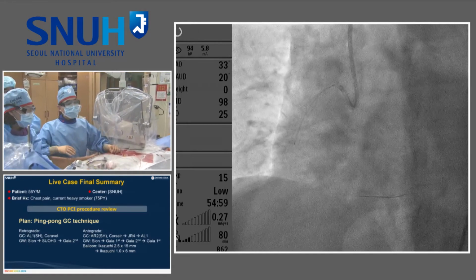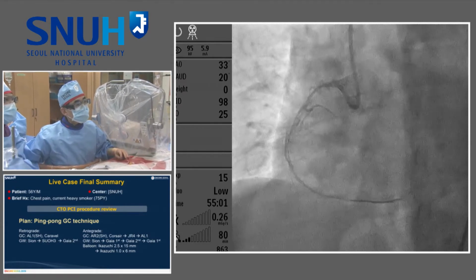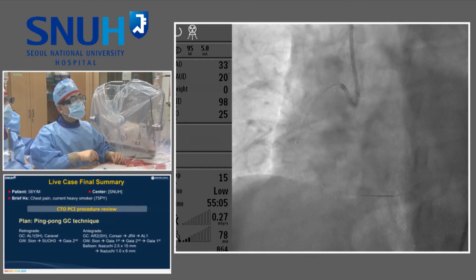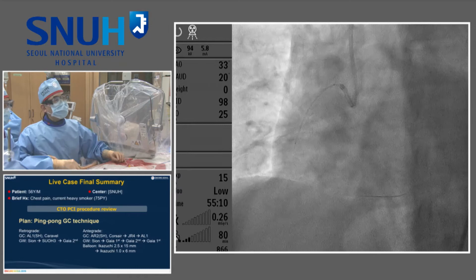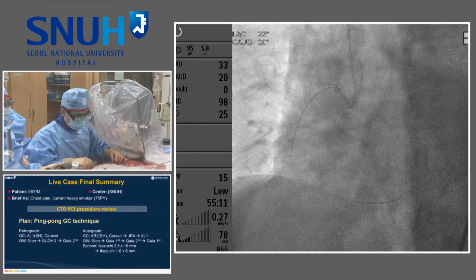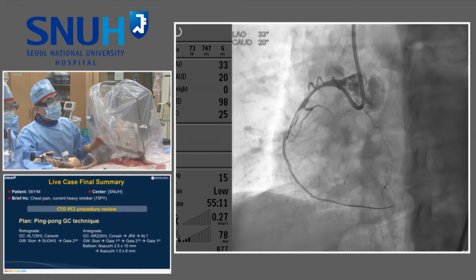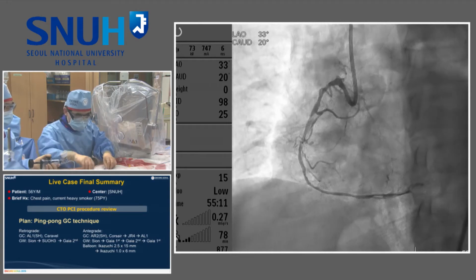오케이, 저장하고요. 테스트 한번 해볼게요. 테스트, 슛. 오케이, 그 저장하고요. So I removed the collateral microcatheter fully. Okay, 다시 쓰네. 슛. Channels are patent, good. Then I put the stent a little bit proximal.